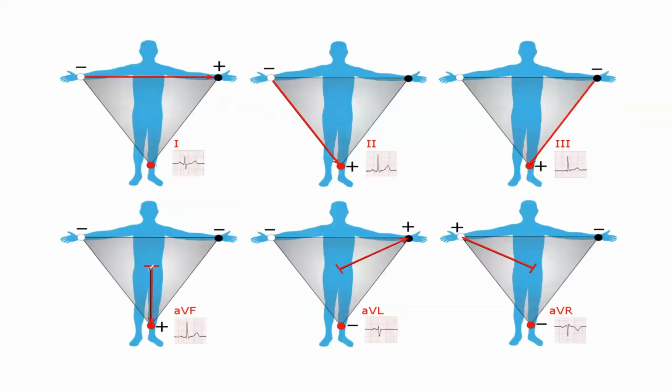It will always come from the center and move towards the organs, for the foot, left arm or right arm, and it will always have the positive charge. So for now, we are having 6 axes.